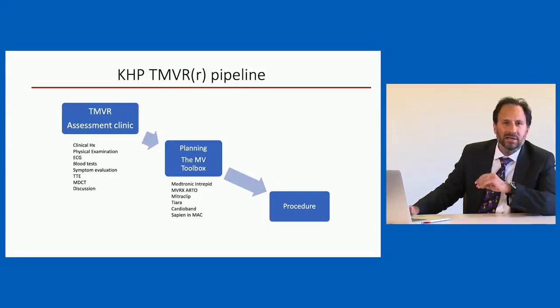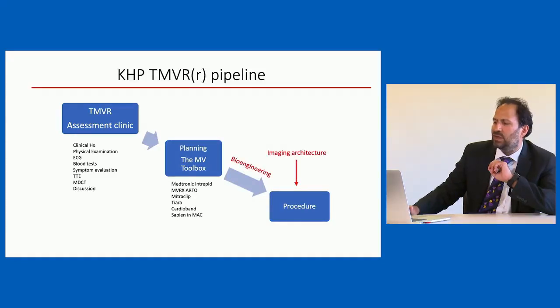And this will be dependent at each institute based on the various technologies that you have available. Now, after we've considered what technologies we have available and what we think are available for the patient, we will then determine which of our imaging strategies we will incorporate above and beyond the basic imaging modalities that we have of cardiac CT, transthoracic echo, and also transesophageal echocardiography.